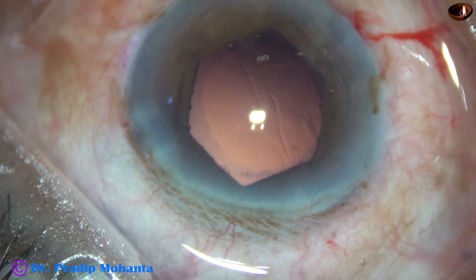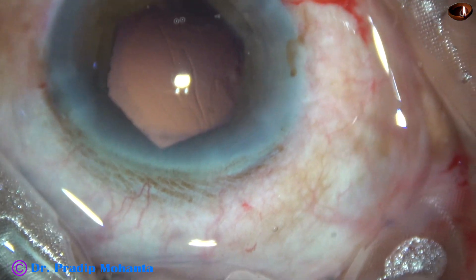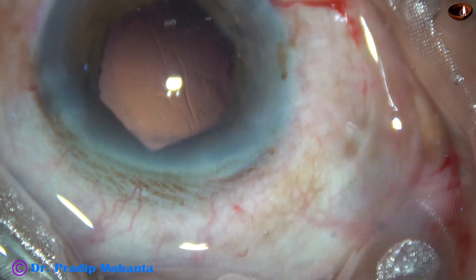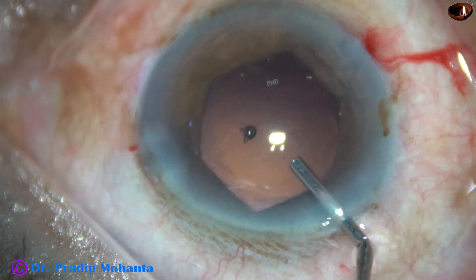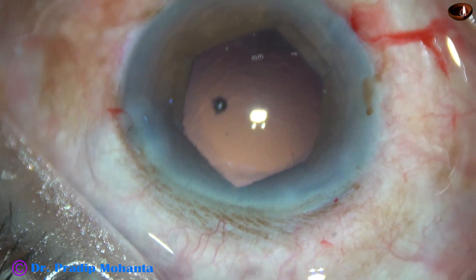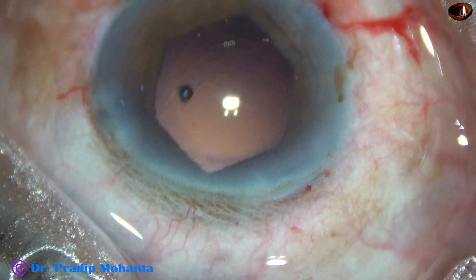The posterior capsule is cleaned. And now, 2% hydroxypropylmethylcellulose is used to fill up the capsular bag as well as the anterior chamber.